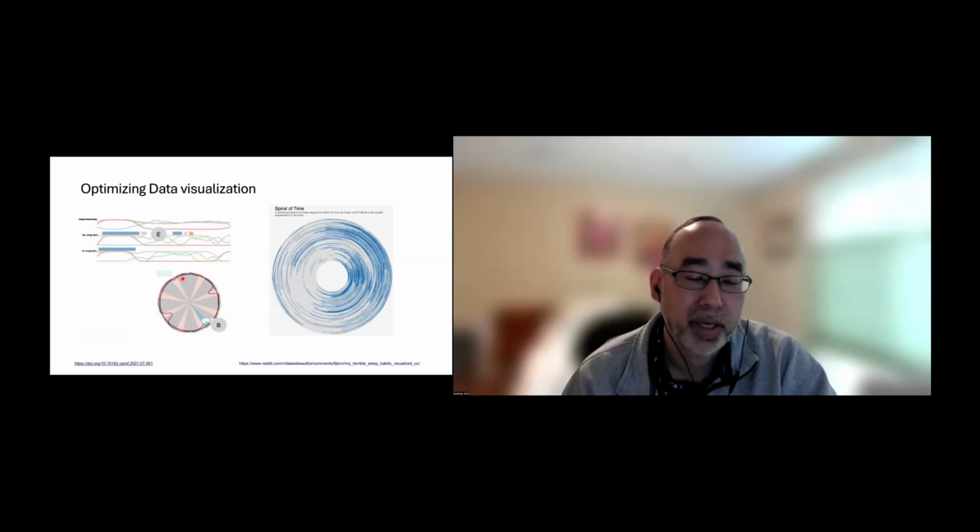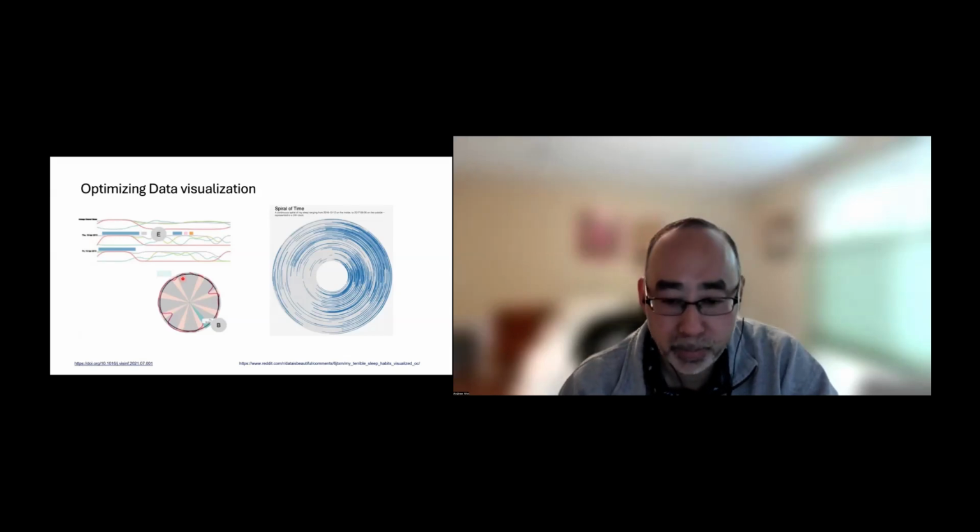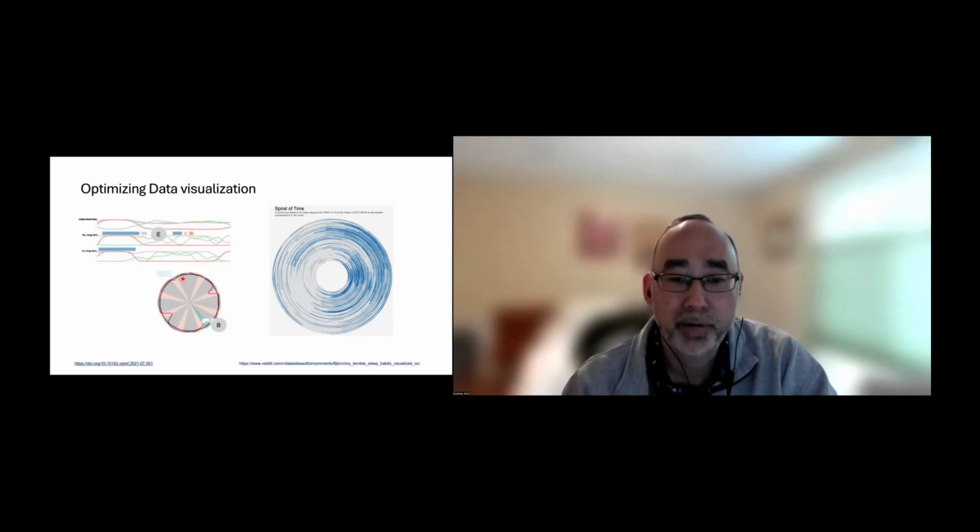And then the next step is finding the best way to visualize the sleep regularity so that participants themselves can interpret the data and take the next step.